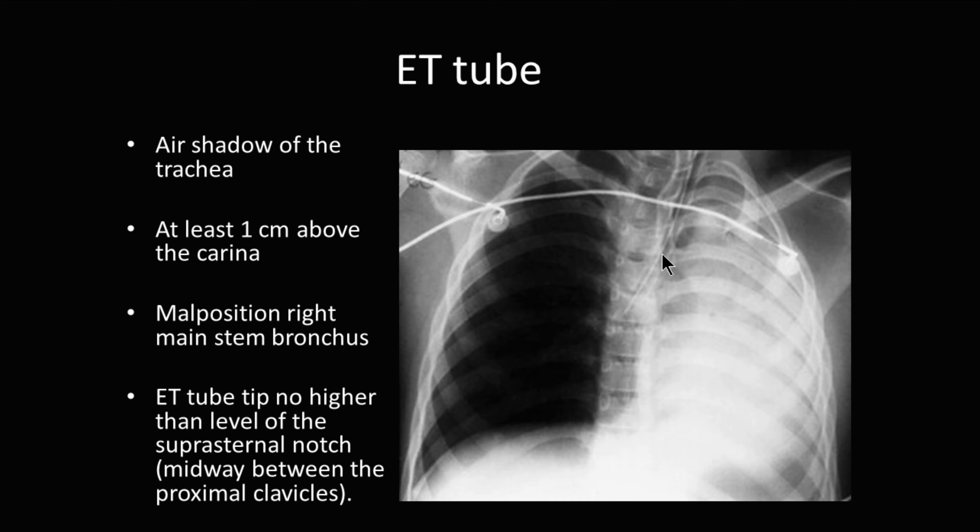The goal is to have the ET tube at least one centimeter above the carina and no higher than the level of the suprasternal notch. This is typically midway between the proximal clavicles in most people. In this case, this ET tube has gone farther down into the right main stem bronchus, and you're aerating only the right-hand lung.